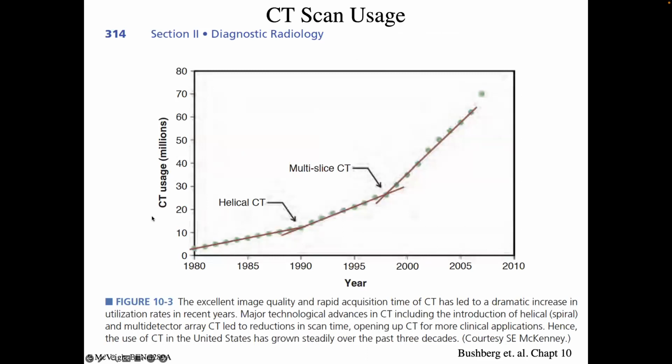So the usage of CT, I mean, it's omni usage in medicine worldwide. These data are pretty old. These end in 2008, and this is probably Medicare usage. Yeah, you get accurate data from Medicare on usage. Getting accurate data for any type of American healthcare delivery is exceedingly hard. Kaiser might have some, with a sizable set, but it's not like Denmark, right? Or Scotland. Like every single person is on the same database in those countries.